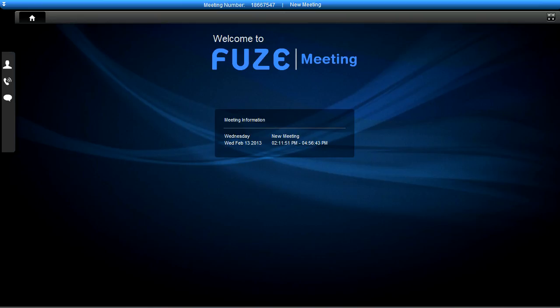Right, if you've got no other questions at the moment, I'll run down to the past and look at their little issue. Everything seems okay. Can we just shut all this down? Oh, you can leave it open, I've got some stuff. Sorry, just close the scanner software, sorry. I'll stop and everything.